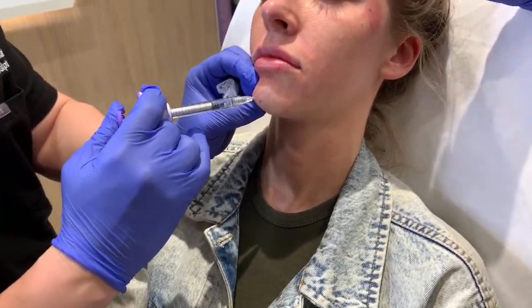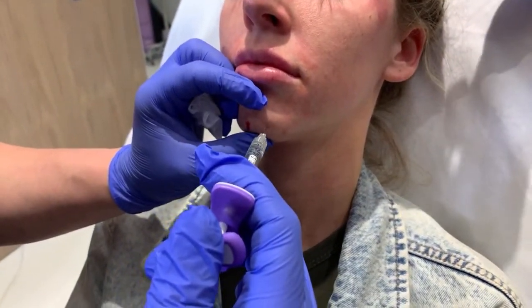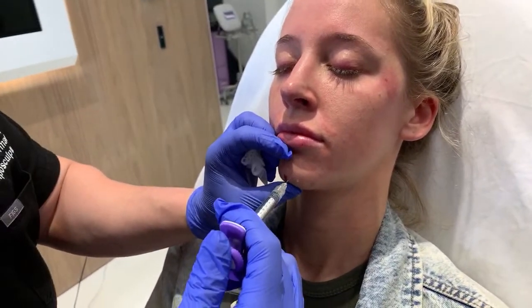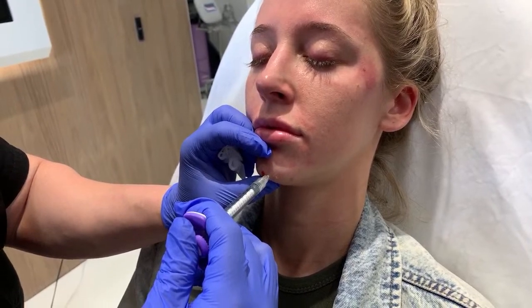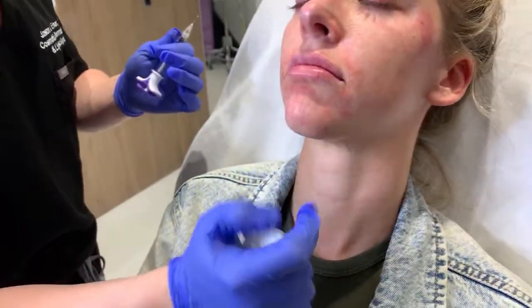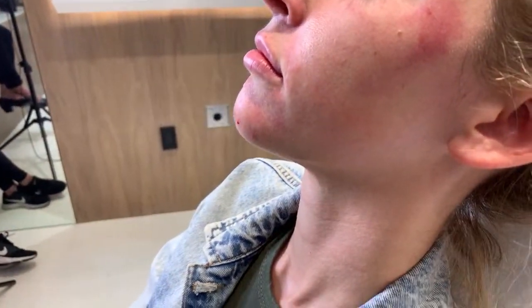You're gonna feel one more pinch after this, okay? Mine does that too. If you do Botox there, it will not only soften the look, but it'll drop the chin muscle so that the filler can project more forward. Perfect. That's gonna do really good right there. This muscle is really strong, so it would drop it down a little bit and make her jawline and chin look more elongated.